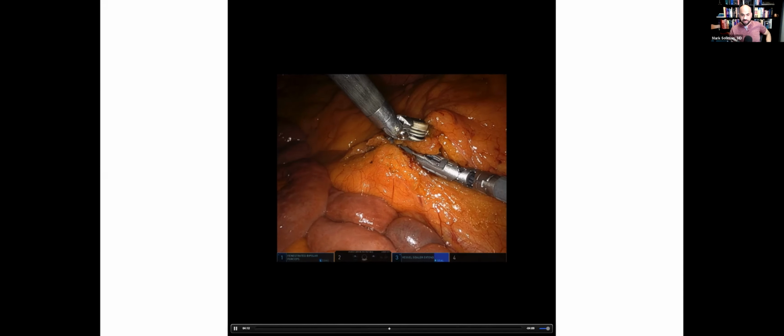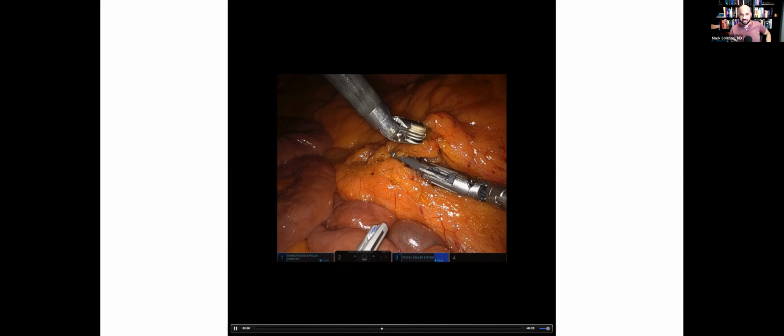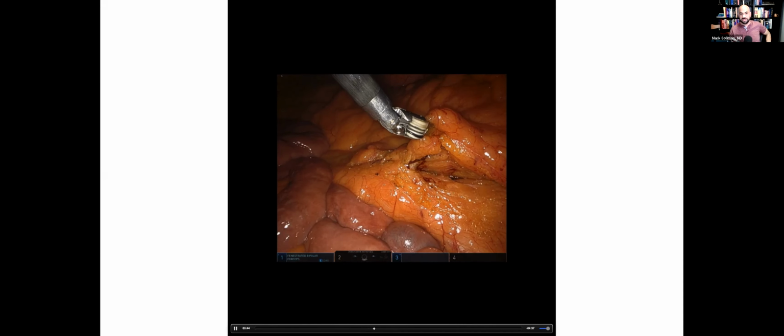Get to a better spot. All right, so let's talk about this actually. I think this is a good video to show what not to do.